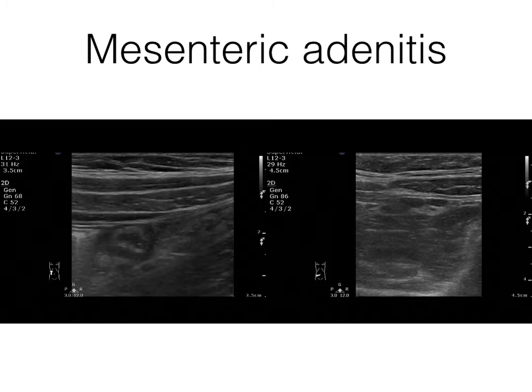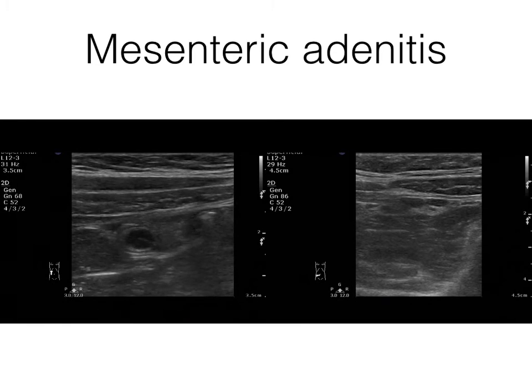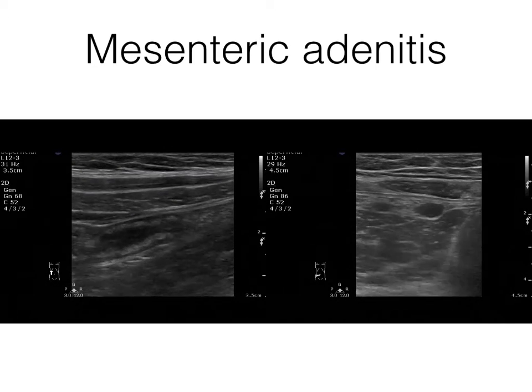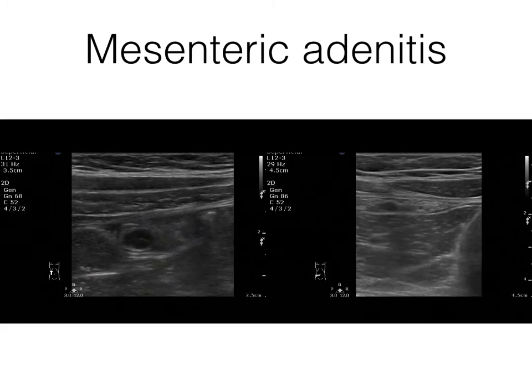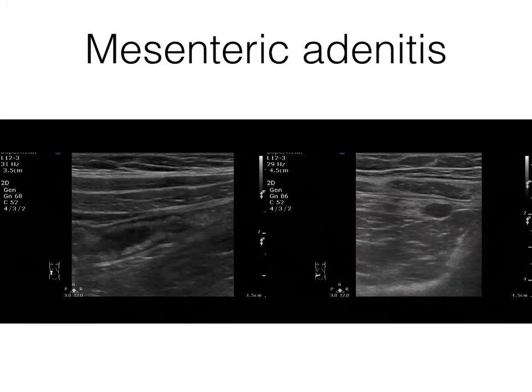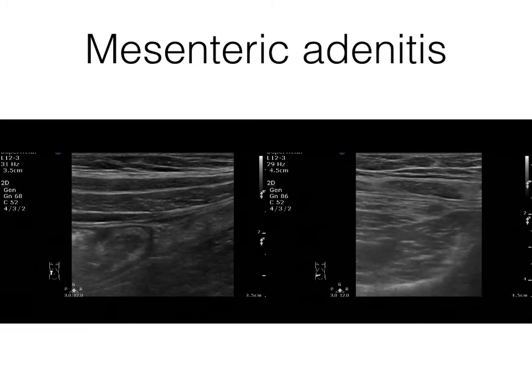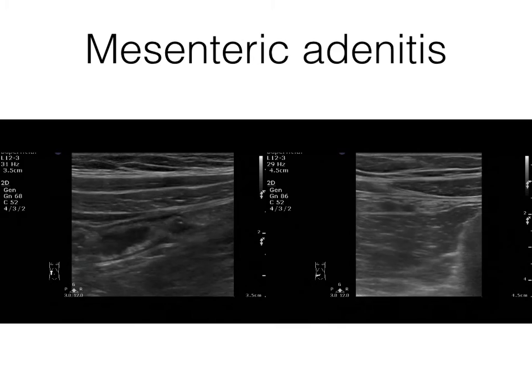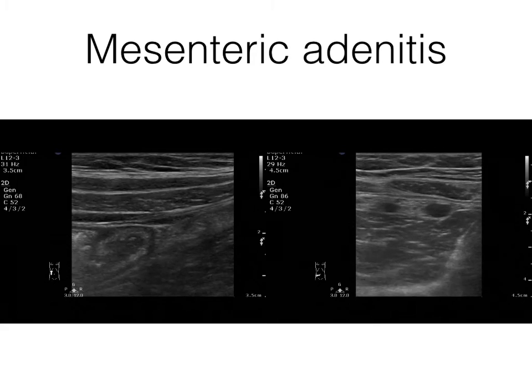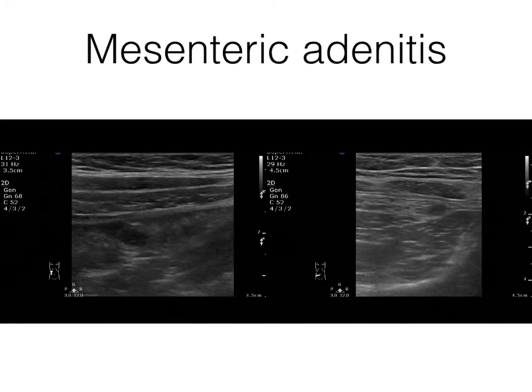Definitely not, right? We have to correlate this pathologic finding with the patient's clinical presentation. Where is the hurting area? The hurting area is here. What is this? When I move the probe, I can see this solitary, black, oval structure. That's a lymph node. So the patient's pain is here instead of these regions. Sometimes we can see an abnormally dilated appendix because of a reactive change to enteritis or PID.